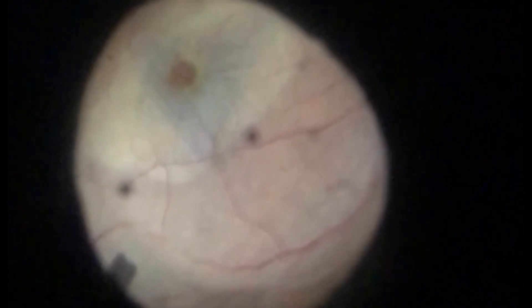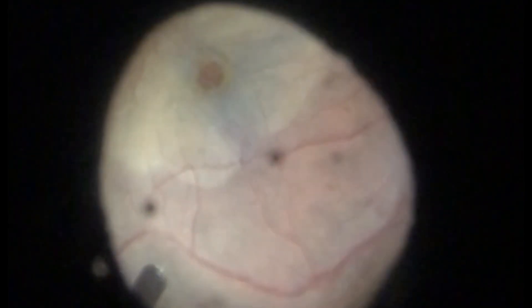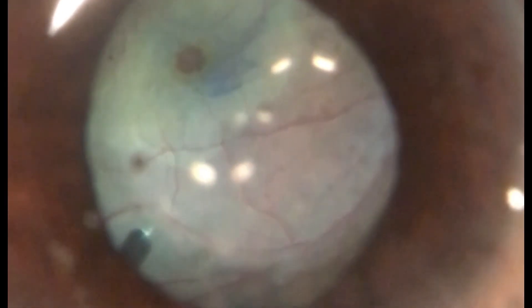After finishing the peeling, due to the mobility of the internal limiting membrane, it is difficult positioning the flap into the macular hole. So the surgeon injected a perfluorocarbon liquid bubble at the posterior pole to stabilize the flap and help to keep it inside the macular hole.